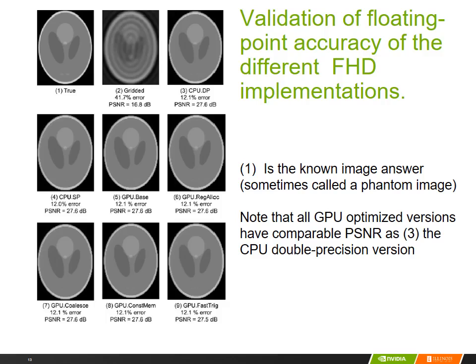When we use the fast trigonometry sine and cosine functions, the hardware implementation, we generate a slightly lower 27.5 rather than 27.6 dB, and this is a very acceptable difference. And so we would be able to use the hardware implementation. Basically, the hardware implementation is sufficient to preserve the significant values of the data generated by the sensors.